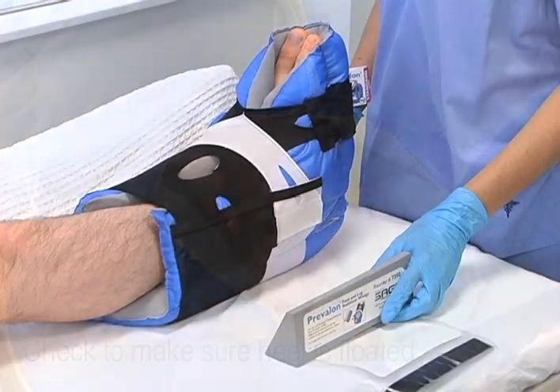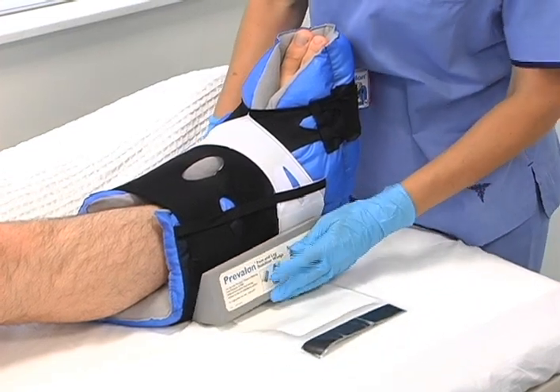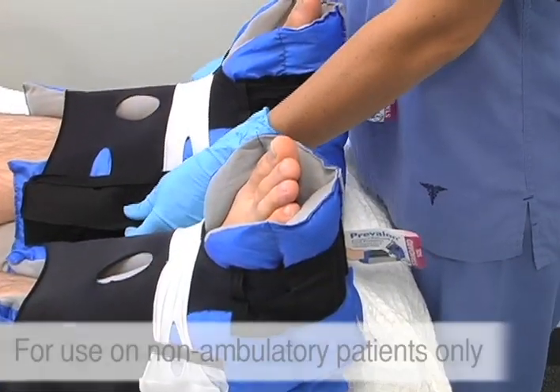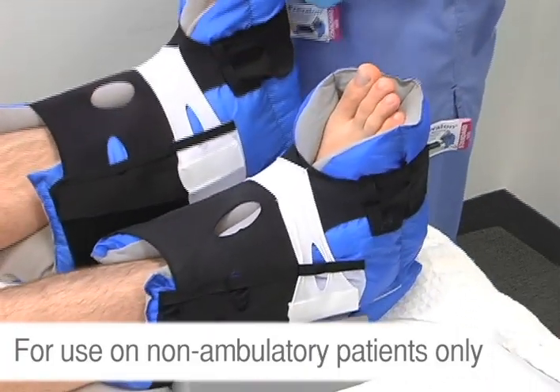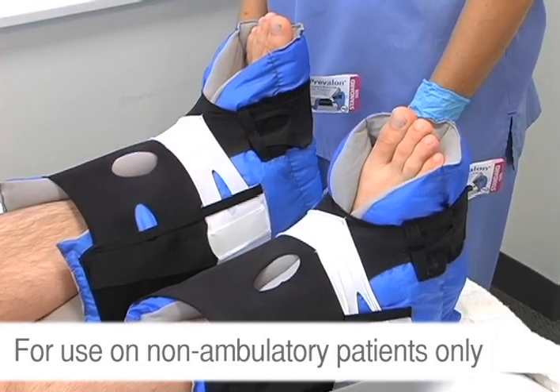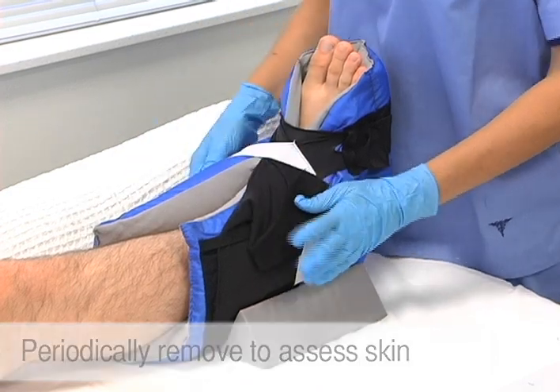If you're using the detached foot and leg stabilizer wedge, slide the wedge across the mattress and onto the outside of the boot. Lift the leg and slide the clear plastic panel under the boot. Remember, Prevalon is for use on non-ambulatory patients only and should be removed prior to ambulation. Do not allow your patients to stand or walk while wearing Prevalon.